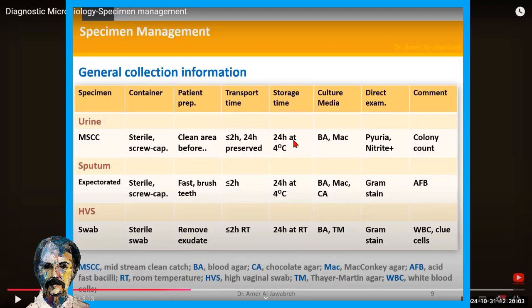So Gram stain is very important to see if we have intracellular diplococci, which indicates Neisseria, and also sediment and wet mount, to rule out if there is a parasite. Plus the culture. Each HVS, high vaginal swab, should have culture, Gram stain, and sediment wet mount. You have to centrifuge and then make a wet mount. These three things. I think we have to stop here.